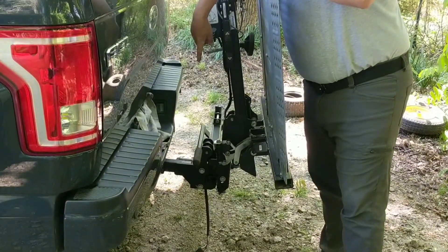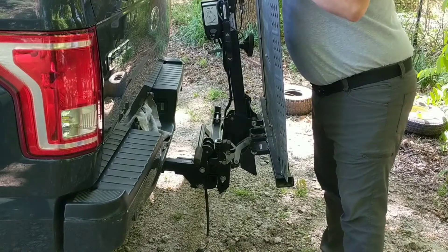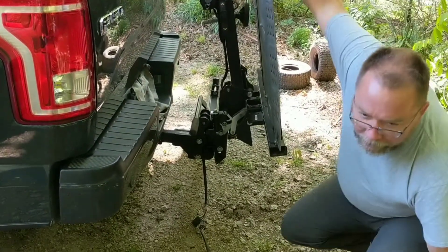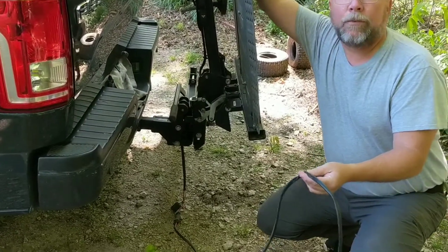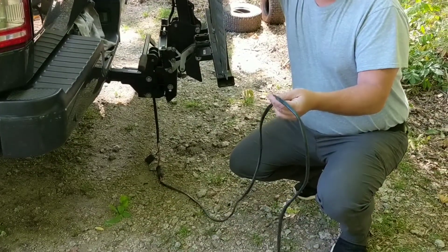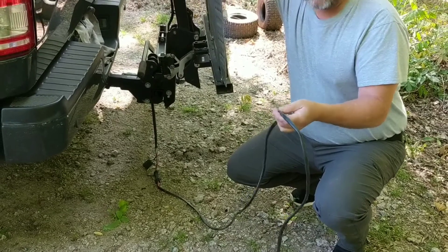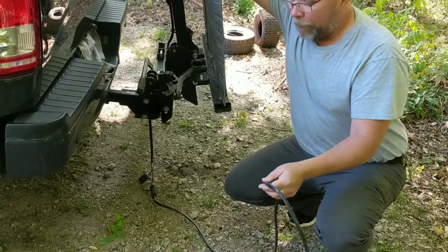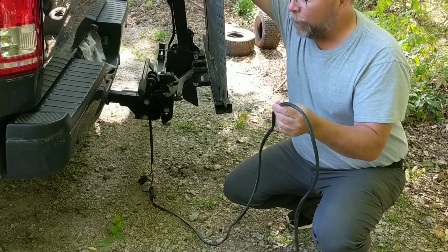What you need on your vehicle is a two-inch hitch. The power, as you can see here, will be direct wired to your battery in your vehicle. For this demonstration we have it hooked up to another battery, but that's what that's for.